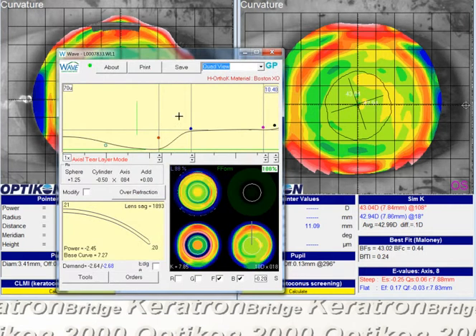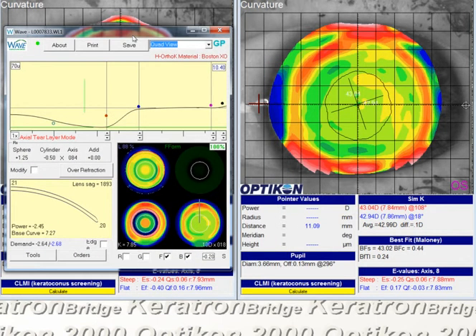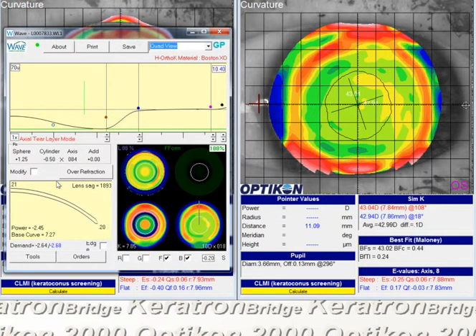Here's the lens that the patient's wearing in the left eye. It's a pretty standard hyperopic ortho-K design. I think what we should do is increase the demand, and I've found that with hyperopic ortho-K it works a little bit better if the lens doesn't move around very much. So a small lens is fine.